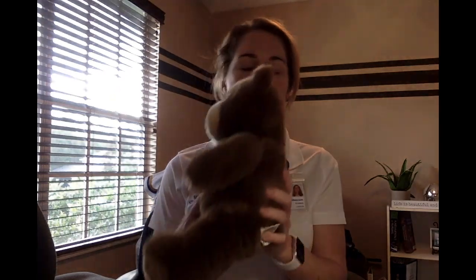You want to note that you wouldn't give more than 1 ml for a subcutaneous injection. Now I'm going to get started. The first thing we're going to do is verify that we have an order from the physician. I have my paper chart and my med sheet right here.